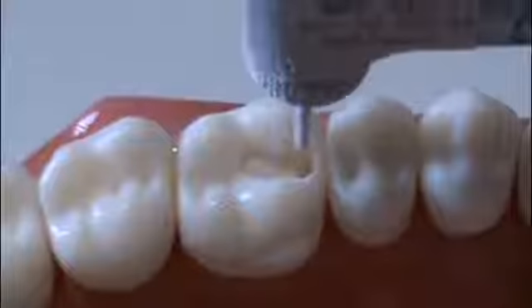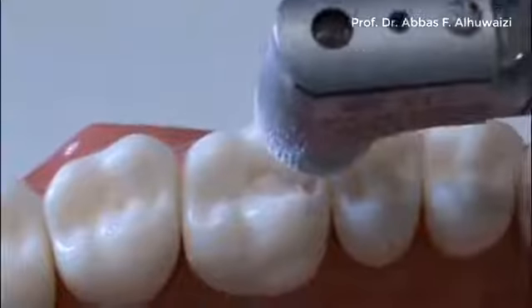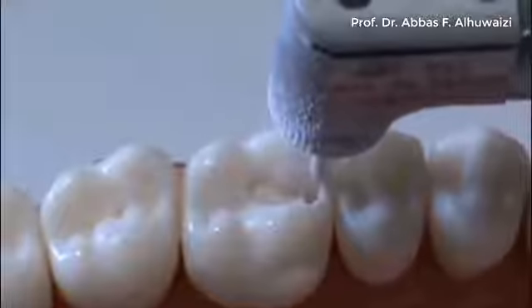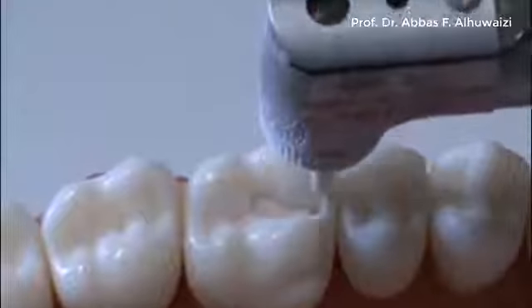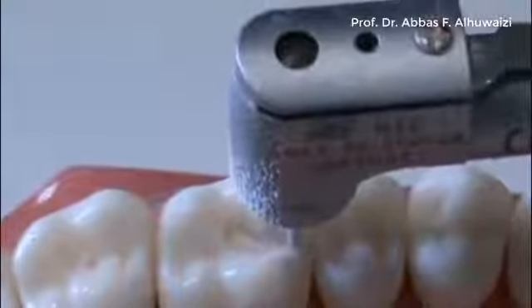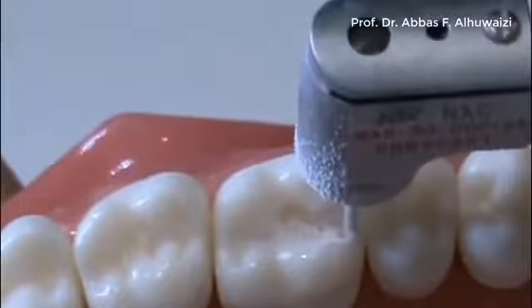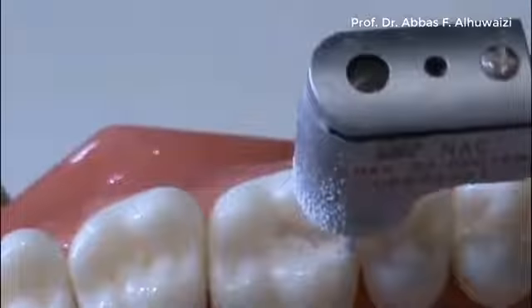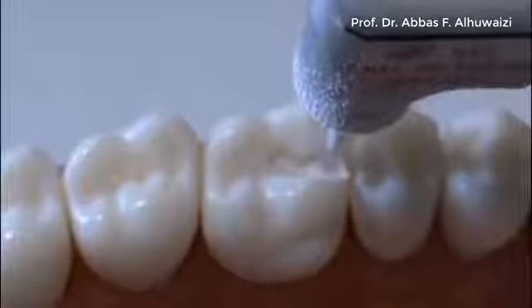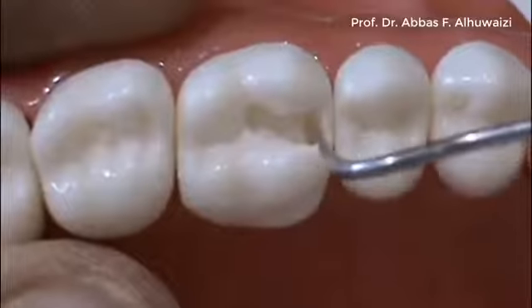Step 3. Thin the wall separating the box from the adjacent tooth. The advantage of leaving this part of the tooth is to prevent hitting the adjacent tooth during cutting.